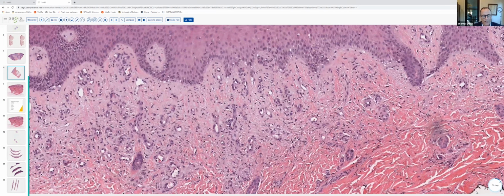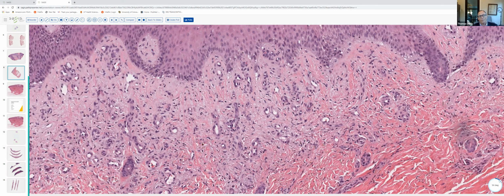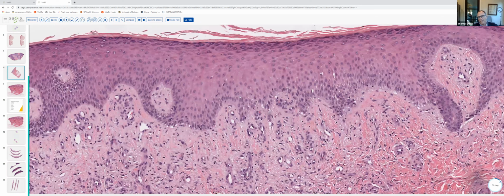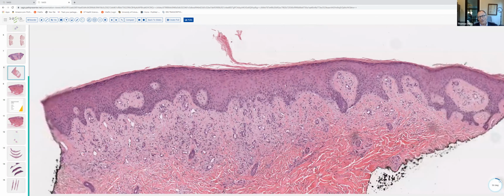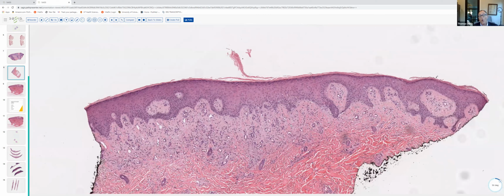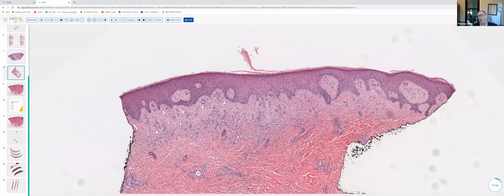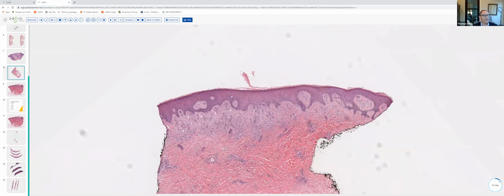Sometimes with stasis dermatitis, one will see lymphocytes and eosinophils and siderophages in the dermis and a little bit more microscopic spongiosis. But again, the anatomic location here helps one out. And a lot of times, in the setting of stasis-related vascular change or stasis dermatitis, there may be an associated or overlying allergic contact dermatitis.